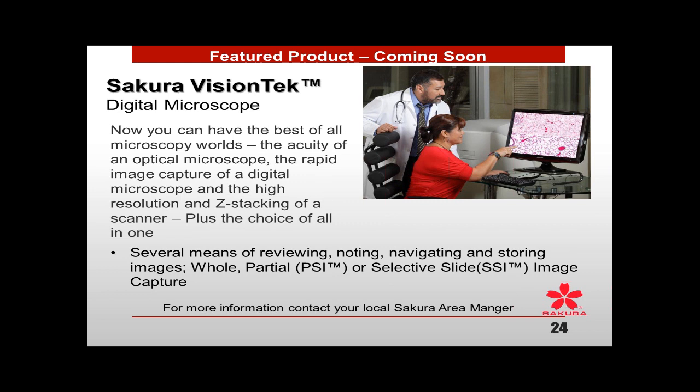Again, pathologists are going to be mostly involved in that. QC, quality controls, can be incorporated into every step, but there is going to have to be a final correlation of glass slide with digital slide. I have our final question. Is there a course or framework for teaching new histotechs on the new technology? How do we educate our staff on these new issues?